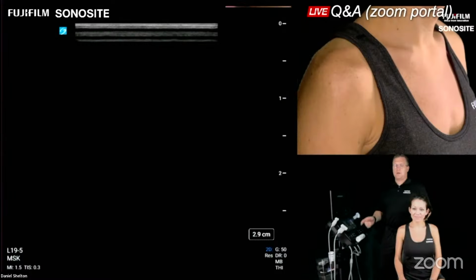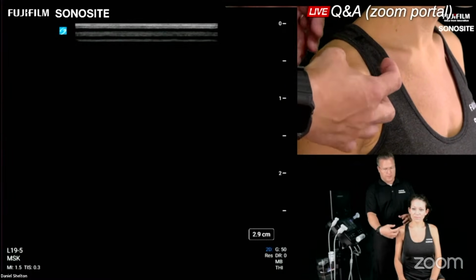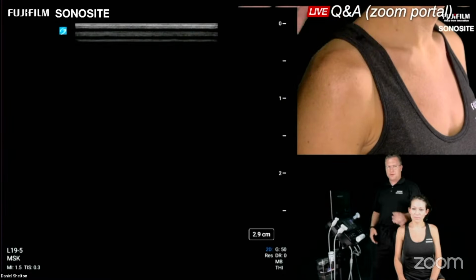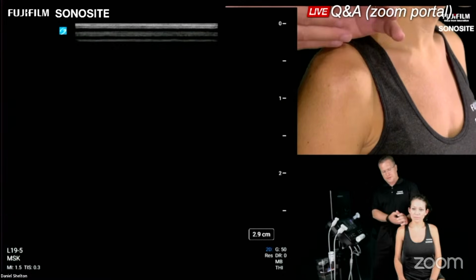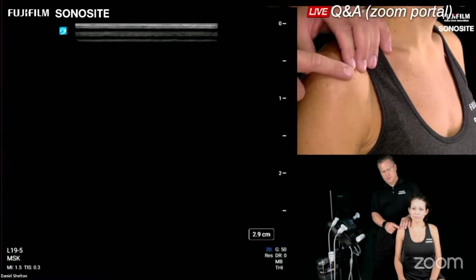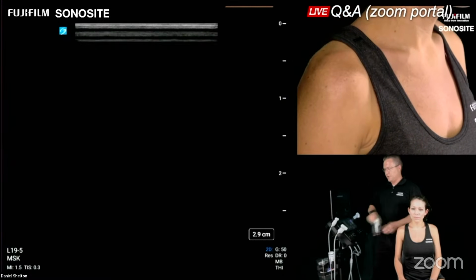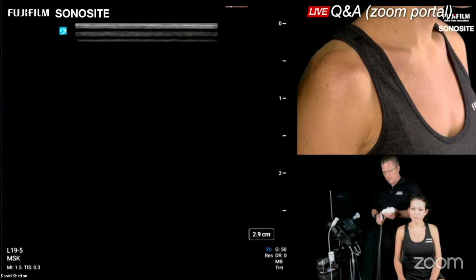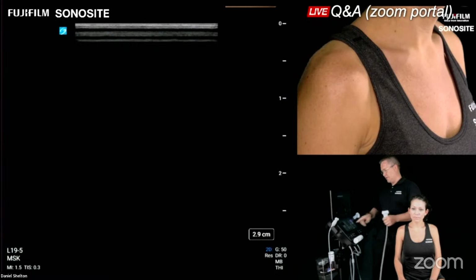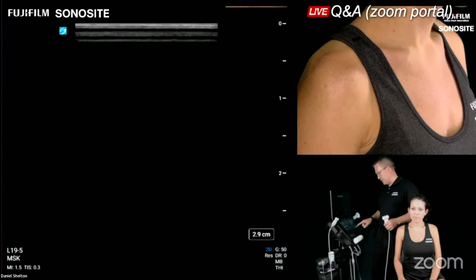So just like on the anterior shoulder, we started with the patient facing the machine. I was standing behind the patient. That's really how I like to scan shoulders because I get to rest my palm up here. And the majority of all your pathology will take place within roughly 1 inch of the acromion anyway. So we're not traveling far away from the acromion, and that's why I like to rest my hand up there. So I'll be selecting the linear 15 megahertz transducer on the Sonosite PX.